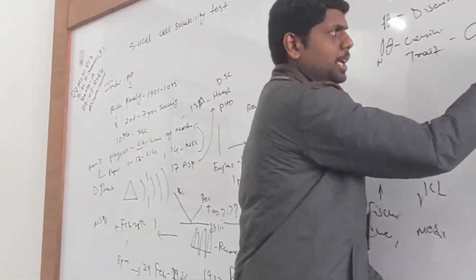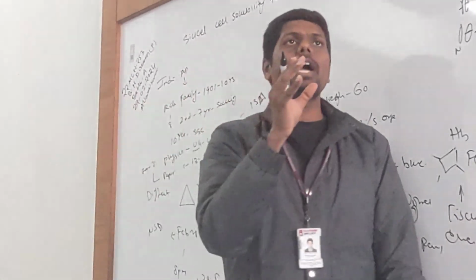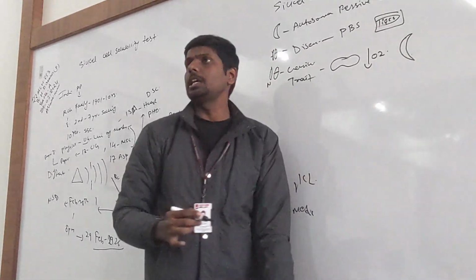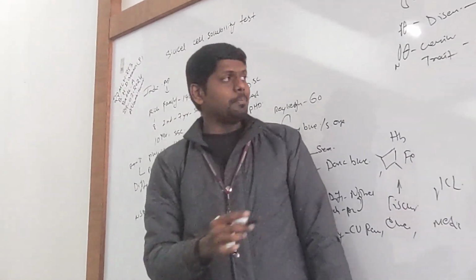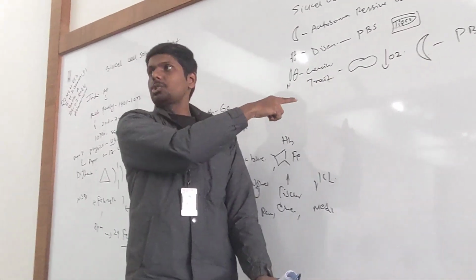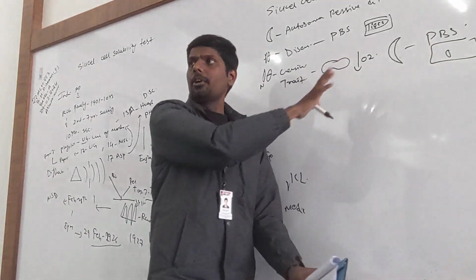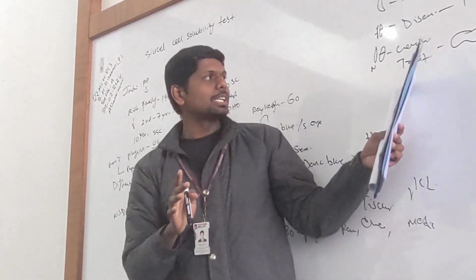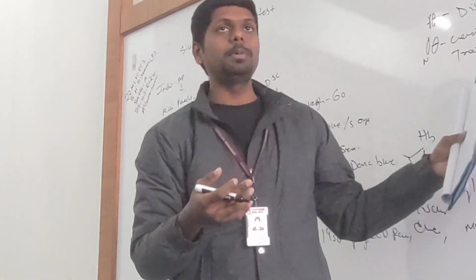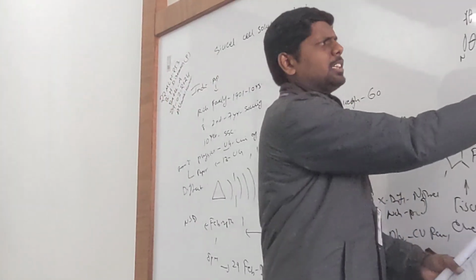But during deoxygenated or hypoxic condition, the cell will transform to sickle shape. That means when you perform PBS on a trait individual, a carrier, you won't see the sickle cells. You will see normal cells. That is how these patients are asymptomatic and they will be misdiagnosed. We won't catch them easily because of this phenomenon. Got my point?